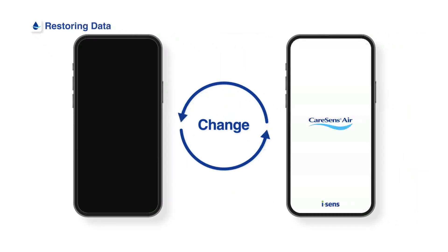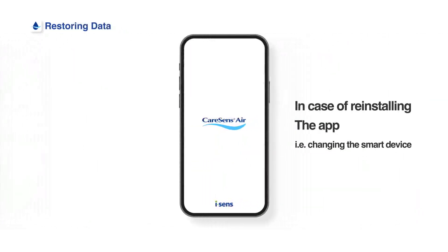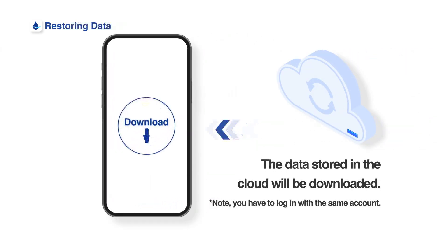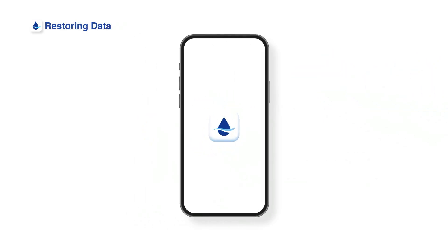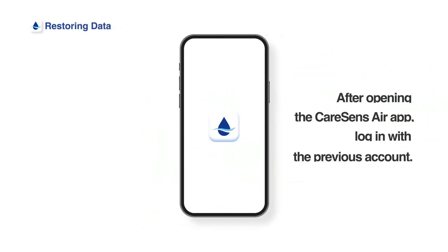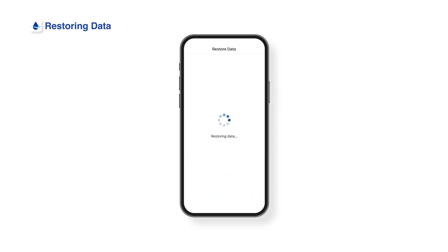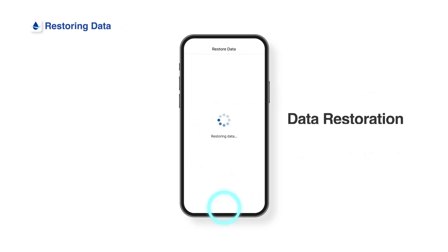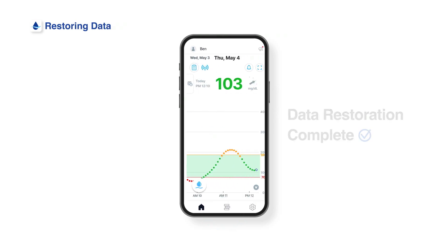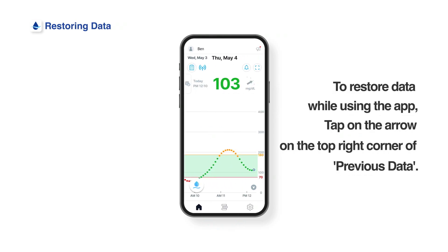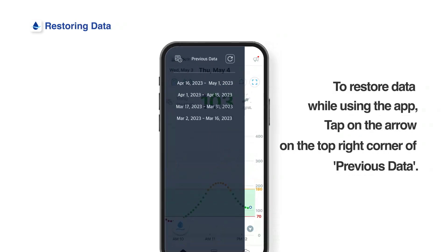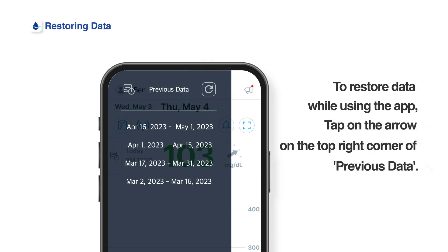If you need to reinstall the app due to changing smart device or other reasons, you can download the previous data uploaded in the cloud server. After reinstalling the Kerasens Air app and logging in with the previous account, a data restoration page will pop up. To restore data while using the app, tap on the arrow on the top right corner of previous data.